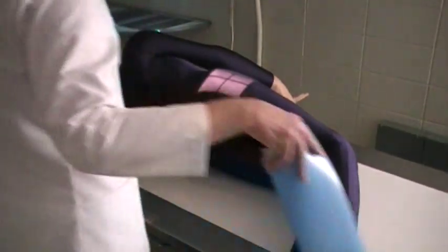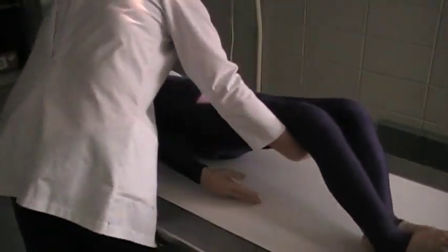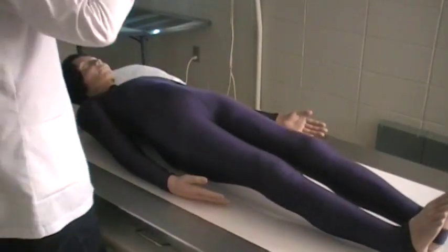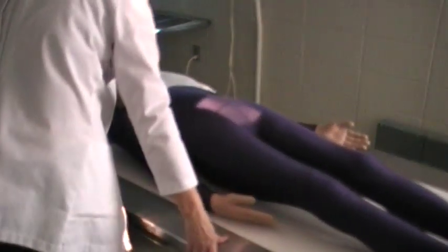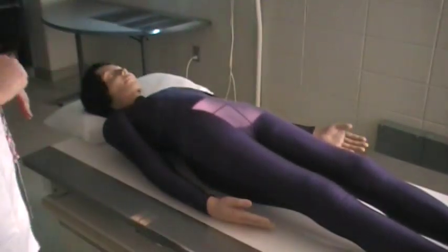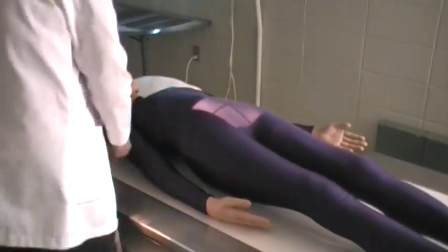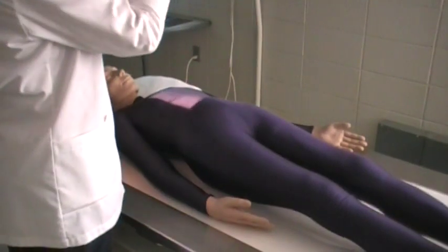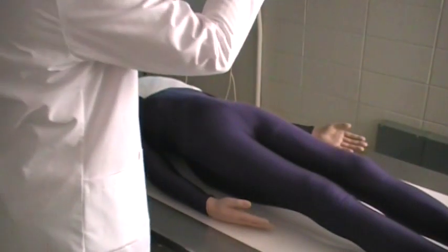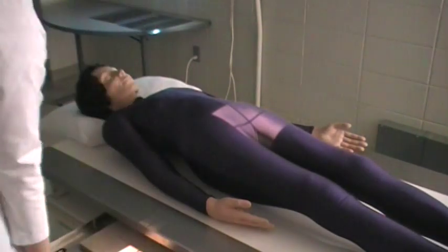For our AP axial, you will have the sacrum and coccyx. Have your patient roll to their back — they will lay flat. The central ray is going to be at the mid-sacral region. We're using the 10 by 12 image receptor or the 24 by 30 centimeter IR. With the sacrum, we're going to have a 15-degree cephalic angle. Make sure that you do line up the bucky tray for that 15-degree cephalic angle.